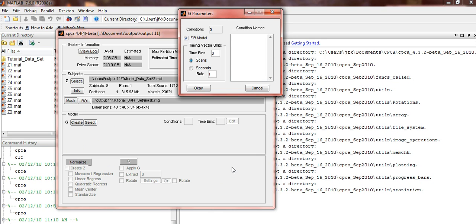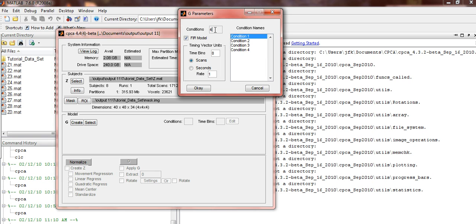You'll see a G Parameters window. In the Conditions box, type in 4. In the Time Bin box, type in 8. Return to the Conditions box and press Enter. You should see 4 conditions listed under the Condition Names. To rename them, double click on them.